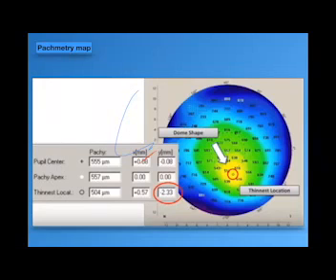You have to suspect this patient as forme fruste keratoconus, and don't go for any refractive surgery, even PRK.